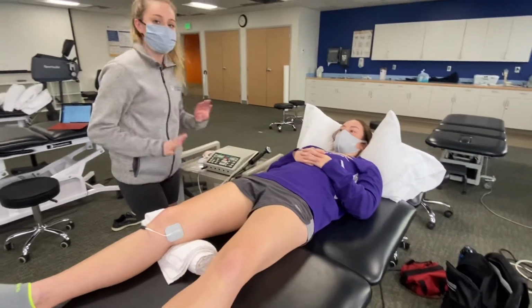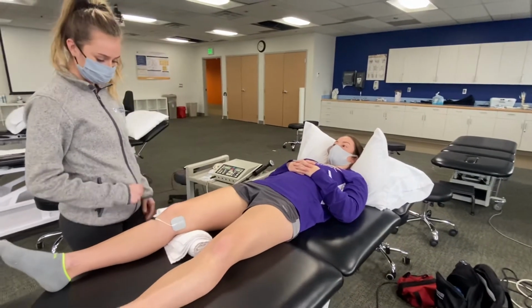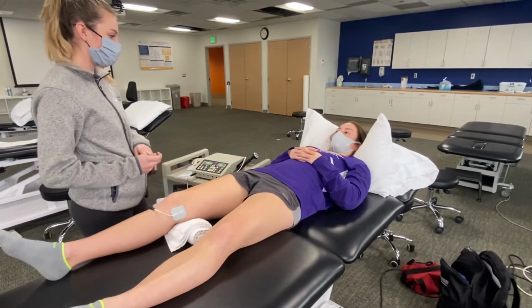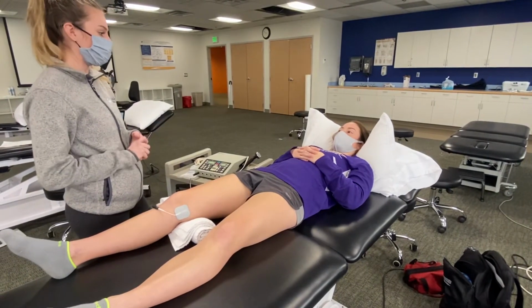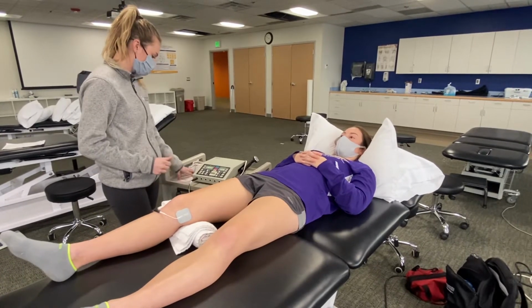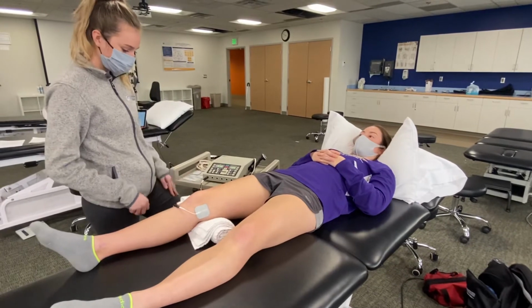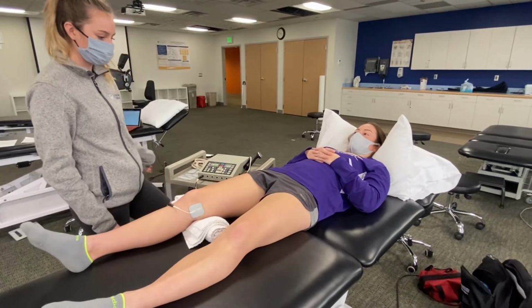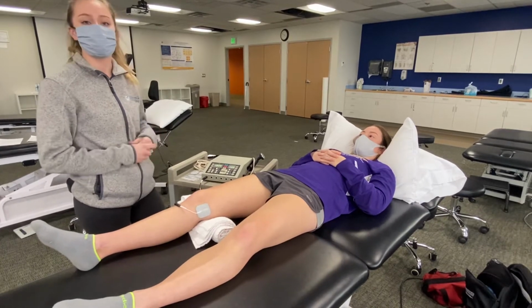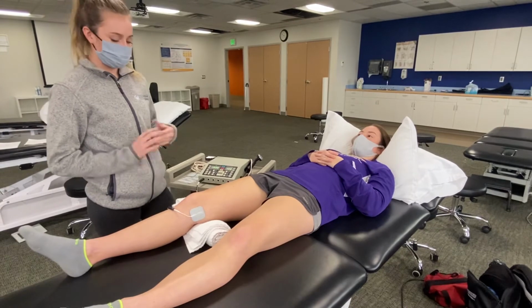I'm going to let that run for just 30 seconds for the video, just to make sure the patient feels good throughout the whole thing. And how is that doing right there? It's good. Good. Just relaxing, feels good for the osteoarthritis? Good. Let it go a little bit longer for you. And if she's having pain in both knees, we can apply to both sides too. But right now she's just having pain in her right.